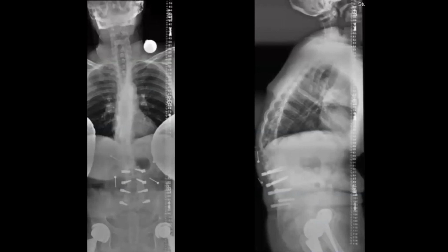This is a patient that I managed several months ago. A patient with a bit of a thoracolumbar kyphosis, who was fused with distraction instrumentation. Many of you recognize this as a semi-rigid fixation from L3 to S1, and this was used as a stabilization rather than as a fusion. So the patient had a laminectomy, a stabilization with distraction. You can see the end result is that from L3 to S1, the patient's really at best neutral, perhaps even a little bit kyphotic, and then kyphotic up above. So now we've got a patient who on a standing film, the C7 plumb line is pretty impressive.